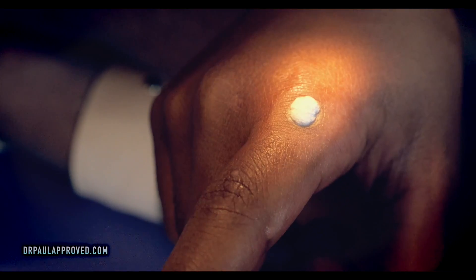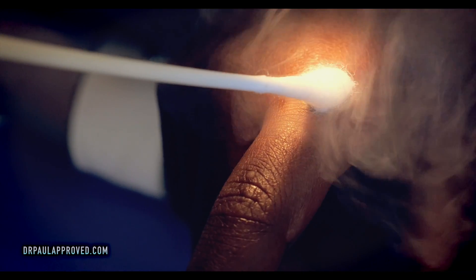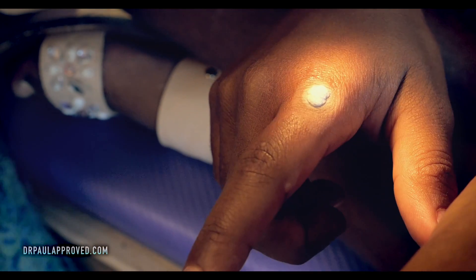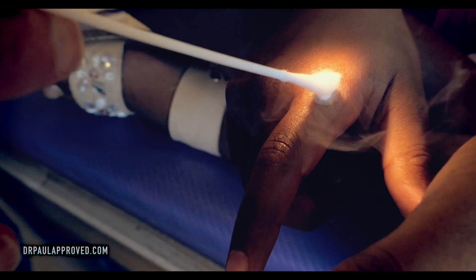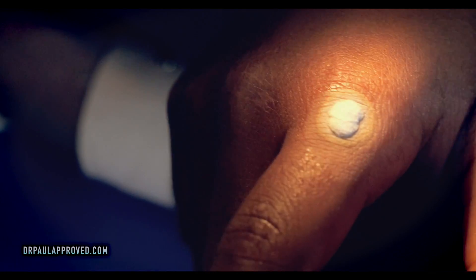So I had some of these on my toes one time. How cold is this? That's a really good question. I suspect this is colder than ice. But you know what we'll do? We'll ask that question of our viewers on YouTube — how cold is liquid nitrogen? And I bet somebody will figure it out.